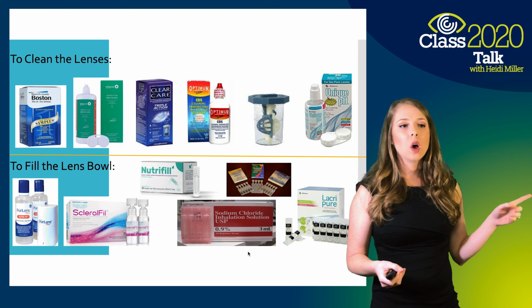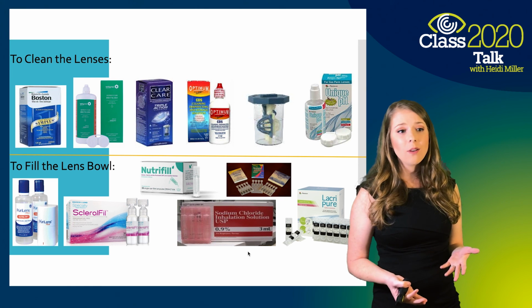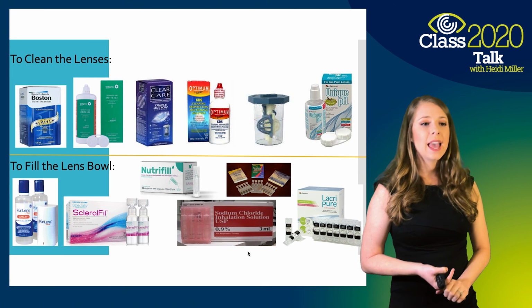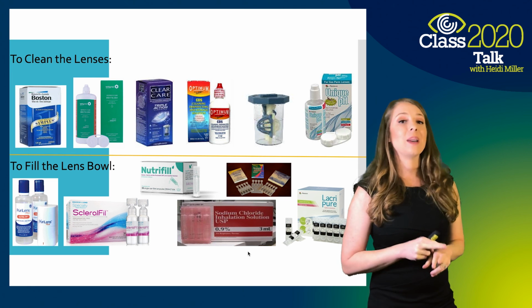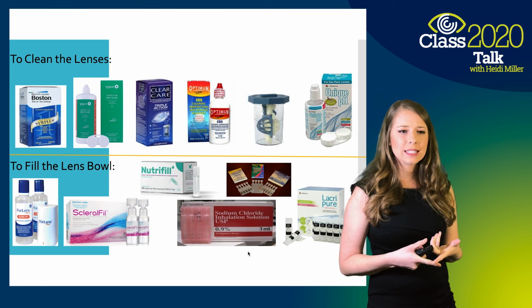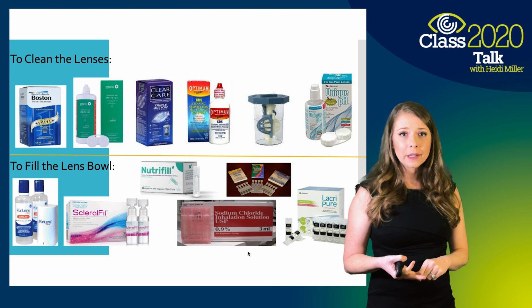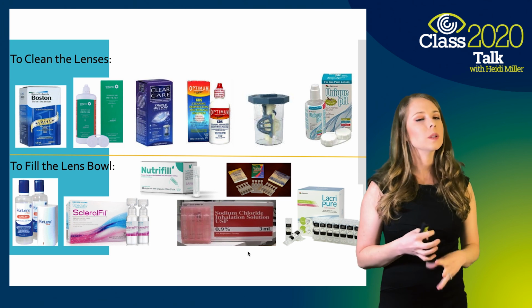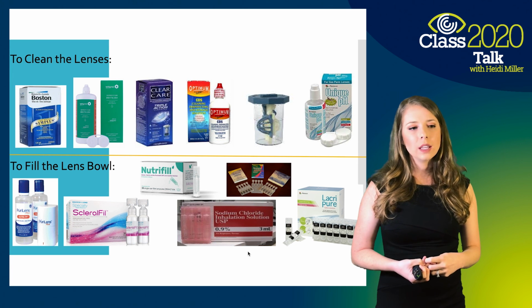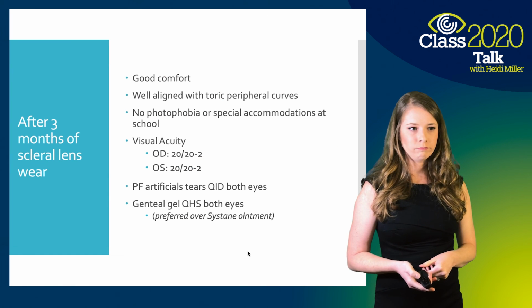With scleral lenses, there's so many different cleaners and there's so many different saline options. We couldn't say this that long ago, but now we're really fortunate to have so many options out there. I'm just waiting for the day when they can find them over the counter. But with her, because of the size and for simplicity to just do a one-step system, I recommended ClearCare because that's safe for GP lenses, and then there wasn't too much involved for the parents to think about. And she was filling the lenses with scleral fill.